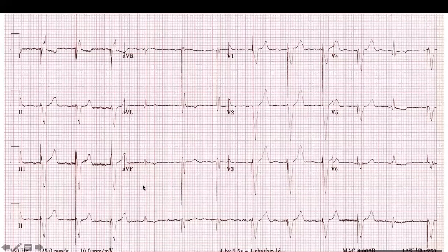Doctor, regarding this ECG or base ECG, is this considered normal or is there something abnormal in the pacemaker since we have a fusion beat? So fusion, you could see it as normal, but if it is too much, sometimes the patient feels it. But there is no harm from it. We could see it a lot.